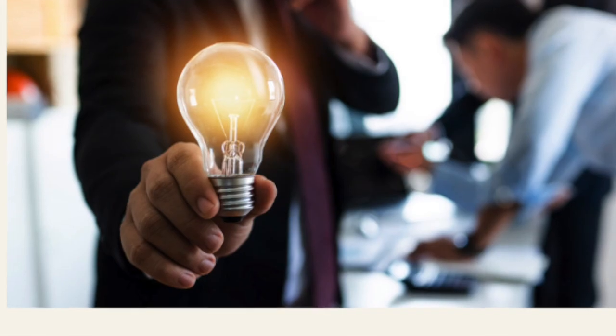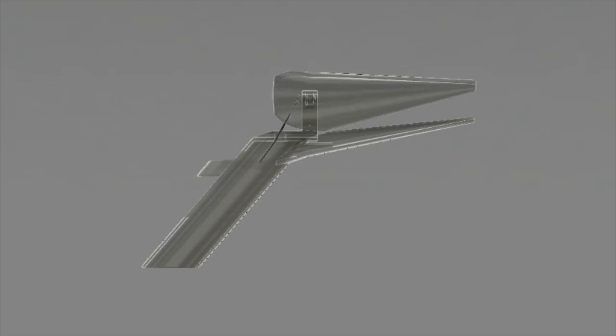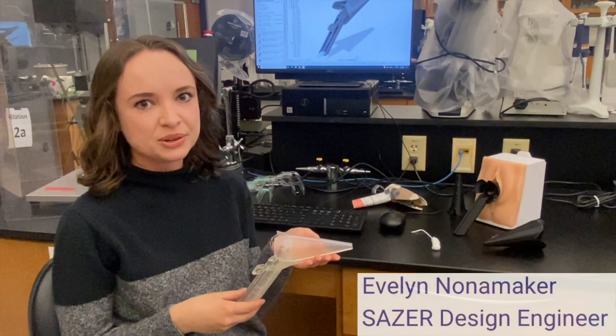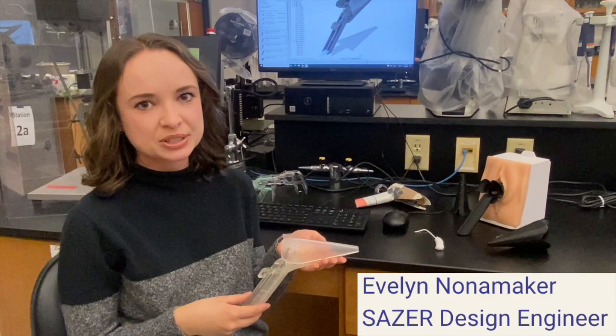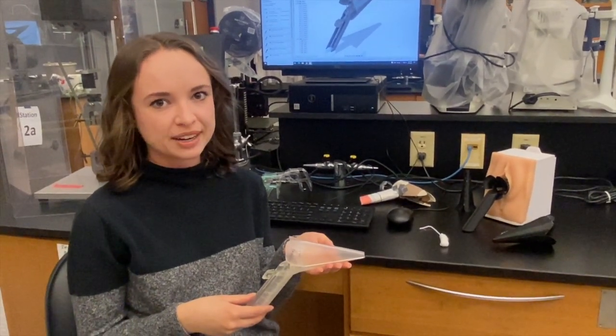This leads us to our proposed solution: the Saser speculum, which boasts a three-blade design made of clear resin, three different speculum sizes, a small insertion diameter, a 130-degree slanted cylindrical handle, and supports single-handed operation. This speculum is new and different from all others currently on the market, featuring a variety of features for both patient and provider comfort.